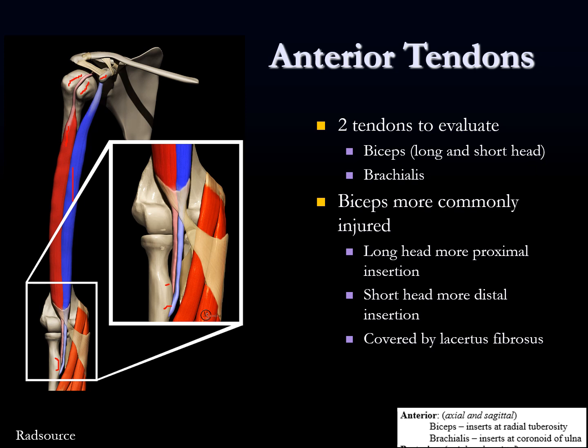Sometimes you can have tears of just one of the biceps heads. If you see a tear that's a little more proximal, call that a long head biceps tear; if it's more distal, it potentially involves the short head biceps insertion. This is covered by the lacertus fibrosus, an aponeurotic structure that begins proximally at the level of the distal humerus and wraps around the ulna at the medial elbow.